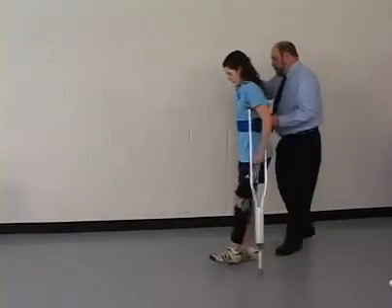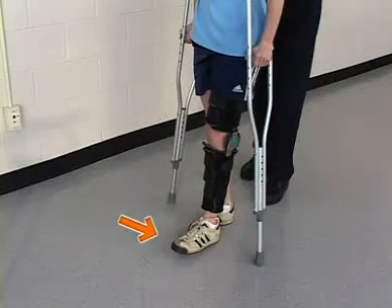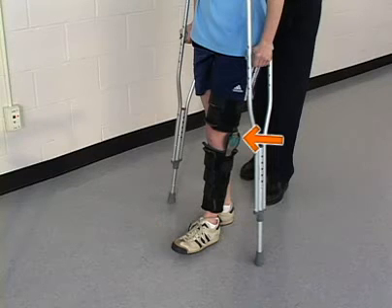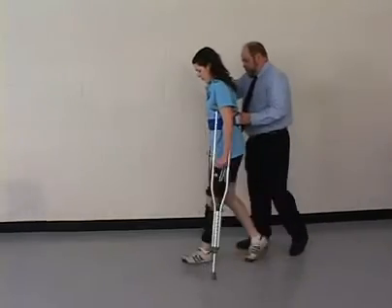Patients using crutches who are non-weight bearing begin in the same position used for determining crutch fit. However, the involved lower extremity is not on the floor. Generally, most patients hold the involved extremity in front when the knee cannot be flexed and behind when it can be flexed. The therapist is positioned in stride behind and to one side of the patient.